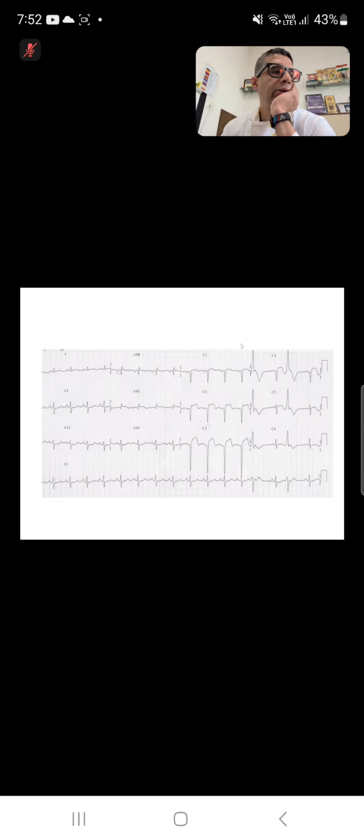Sir, do you want to add anything? See, continuing on what you said about the ST elevation, also note that if it is already a completed MI, after a few days, persistent ST elevation, even in L1 and AVL, apart from other leads, with hardly any significant T wave inversion, is a dangerous sign. It is a sign of regional pericarditis and impending rupture. This patient needs an MRI, etc.